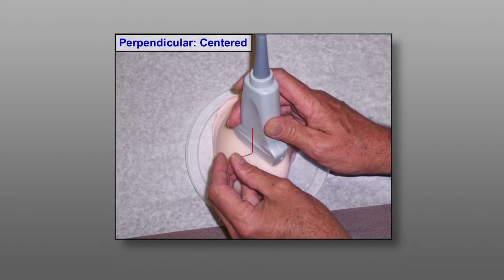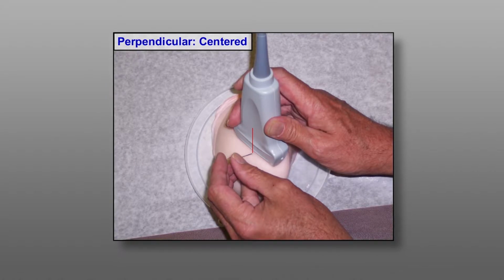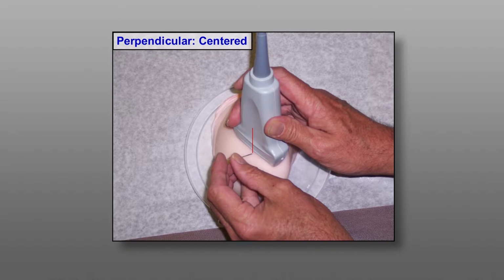For superficial targets, the needle will be placed with a flatter angle, and for deeper targets, the needle will be placed with a steeper angle.